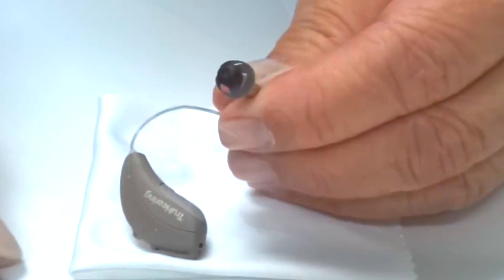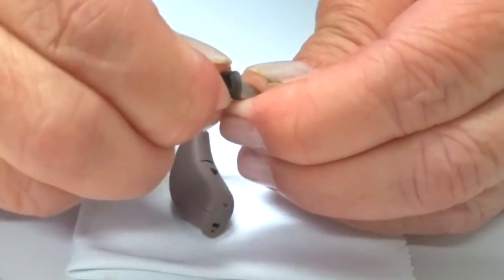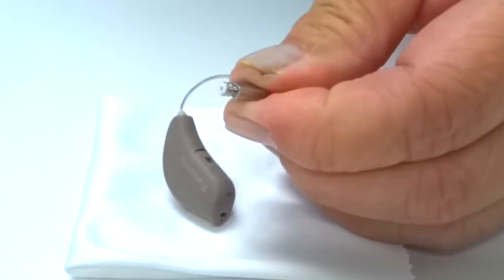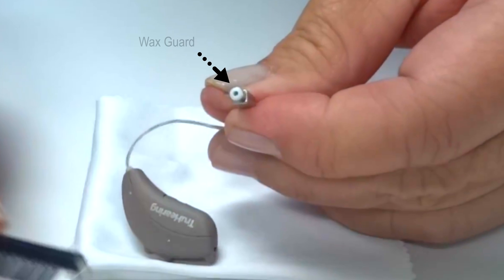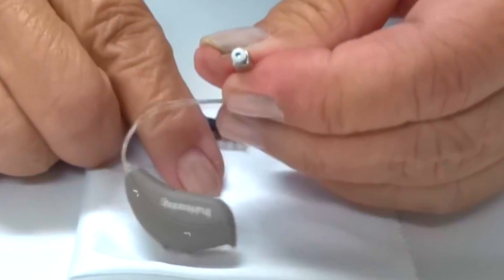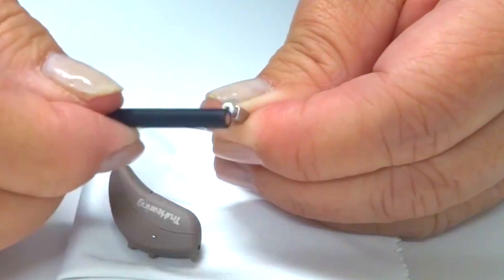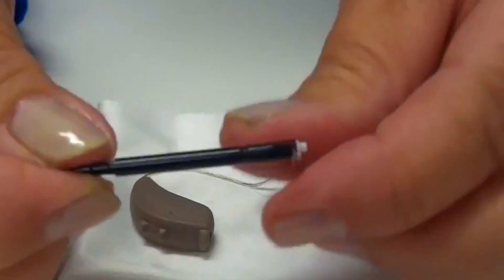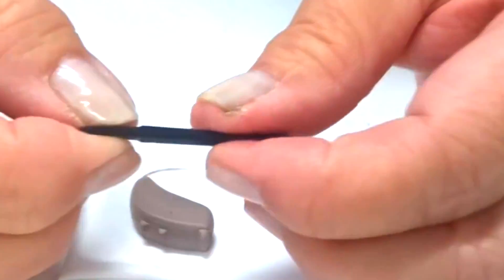This will expose the white wax guard. Try to remove any debris from the wax guard using a brush. If unsuccessful, replace the wax guard with a new one as demonstrated here.